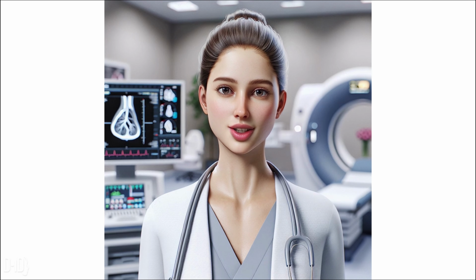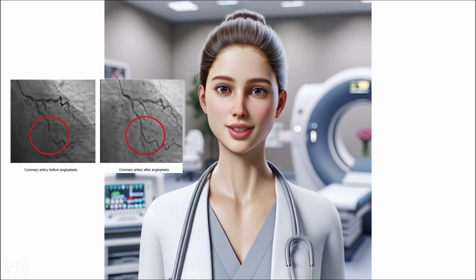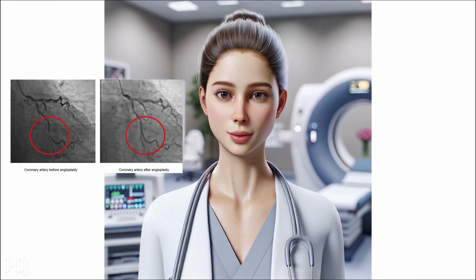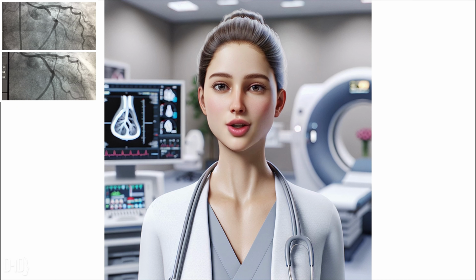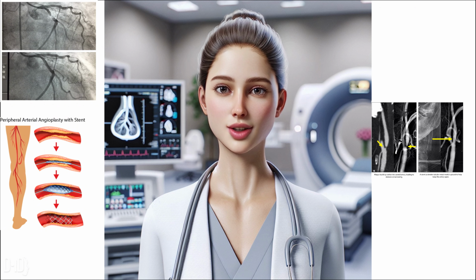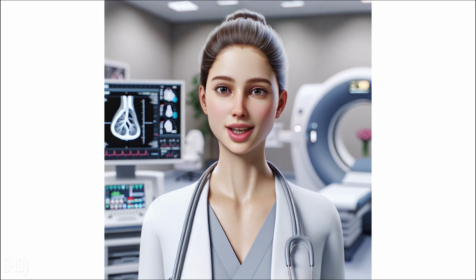Angioplasty is a medical procedure used to open blocked or narrowed blood vessels, typically arteries, that supply blood to the heart, brain, lower extremities, or other parts of the body. It is commonly performed to treat conditions like coronary artery disease, peripheral artery disease, carotid artery disease, which can restrict blood flow and lead to chest pain, heart attack, stroke, cold leg, or other complications.